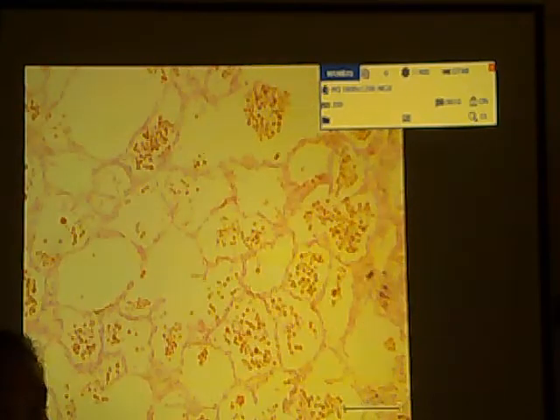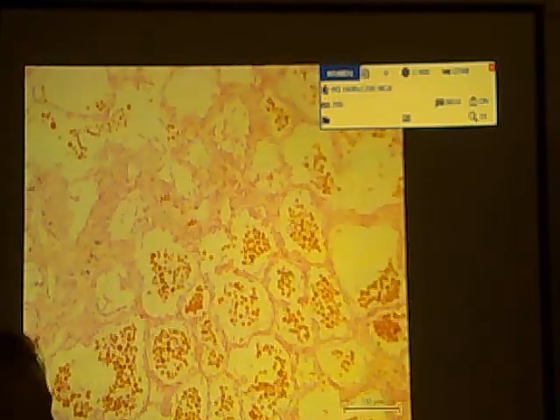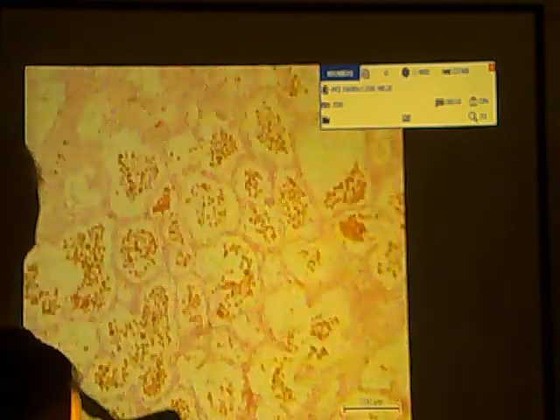Where is your interstitium? Thickened but not fibrotic. So those are the tissue in between your alveoli. It is thickened but not fibrotic.